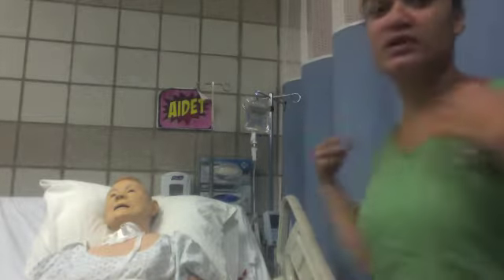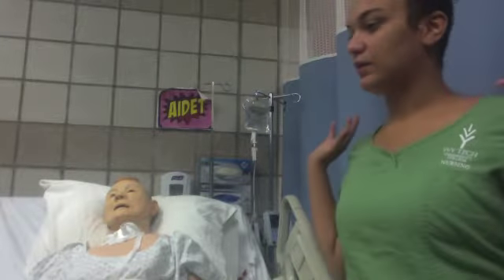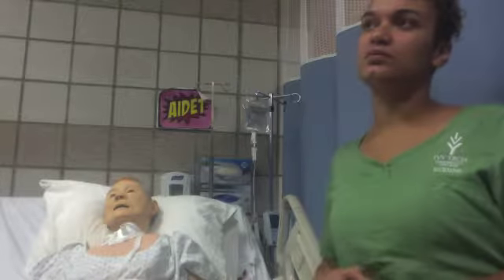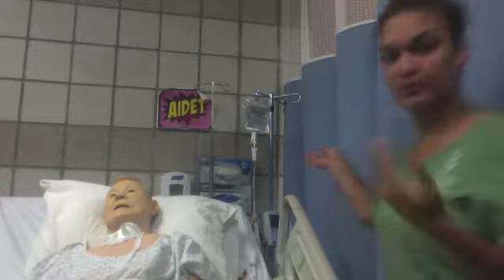I've already verified who we are, provided privacy, gathered my supplies and put them on the bedside table. I've already done hand hygiene. Probably will do it again. But so we are going to just start by jumping right in. I've already verified any medications, making sure that they were given 30 minutes prior to my blood administration. I've already identified who my patient is. We've already done all that, so we're going to go ahead and I'm going to provide hand hygiene.